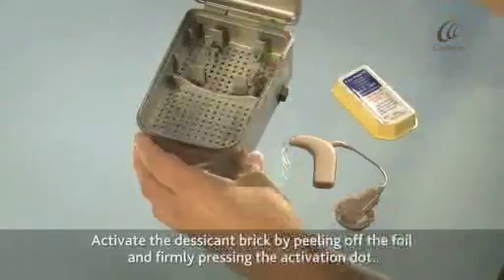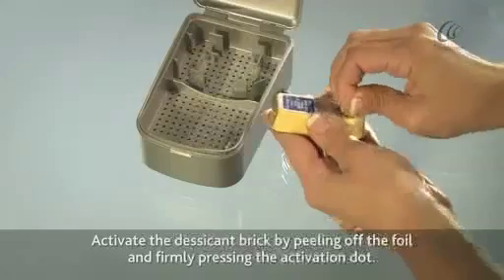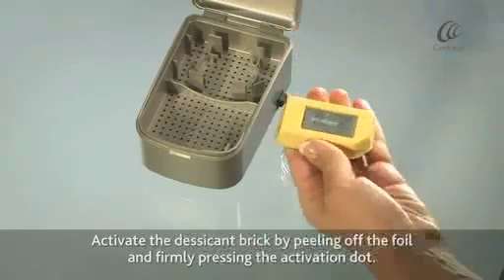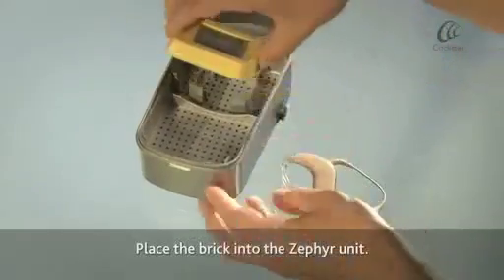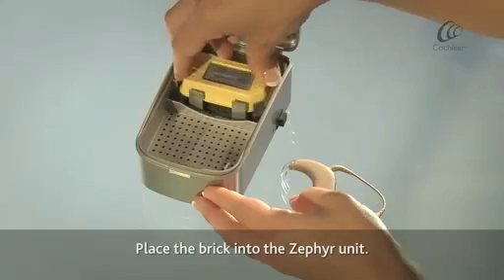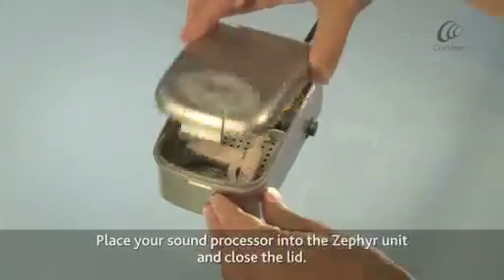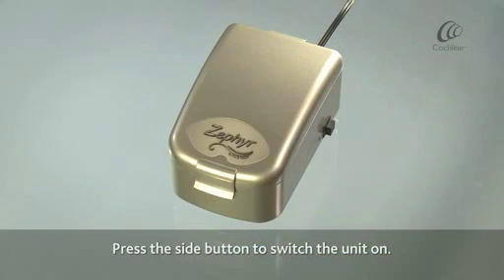Activate the desiccant brick by peeling off the foil and firmly pressing the activation dot. Place the brick into the Zephyr unit and close the lid. Press the side button to switch the unit on.